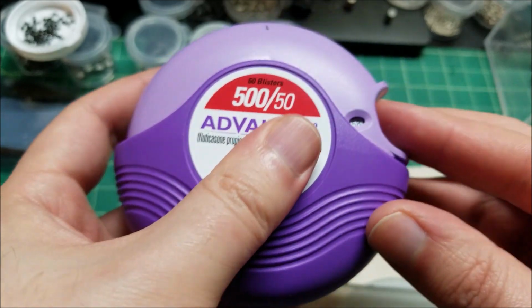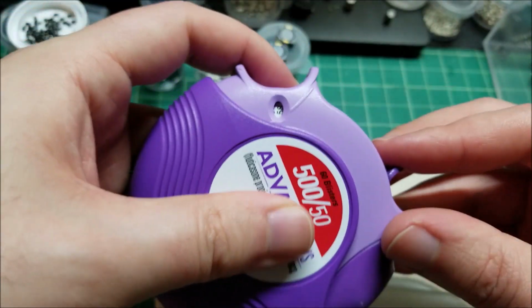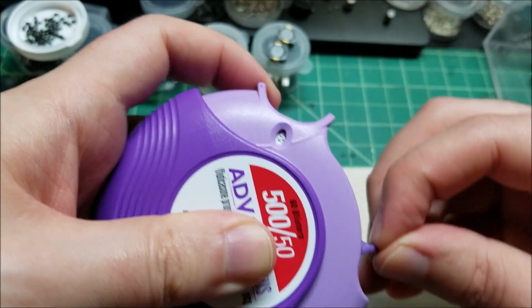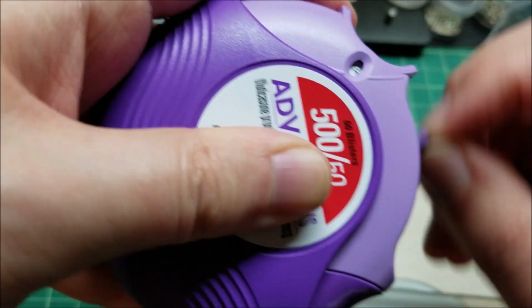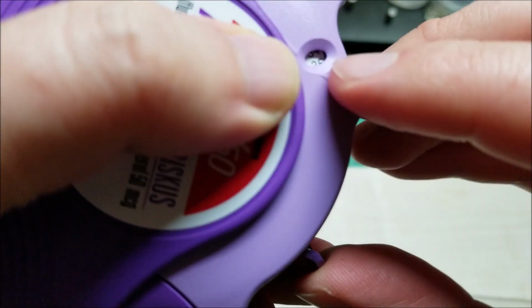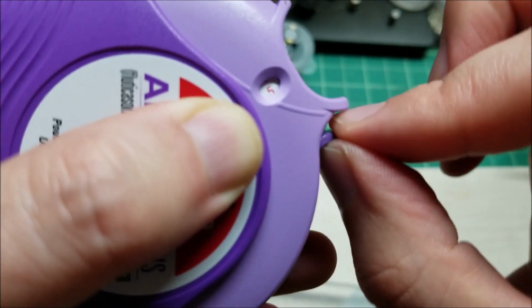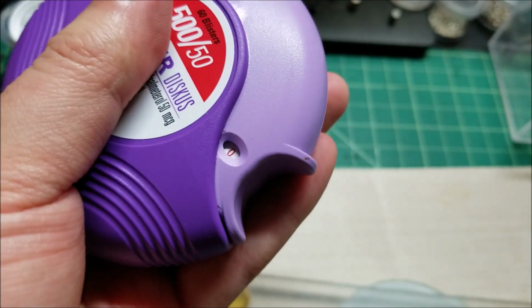Okay, one last quick thing. I actually reset the count mechanism, so it's at 58 right now. And it goes to 57. You can see it ratcheting. 55, 54, 3, 2, 1, 0. Slightly misaligned. I think I maybe got it over one gear. 10, 9, 8, 7, 6, 5, 4, 3, 2, 1, 0. So there we go.